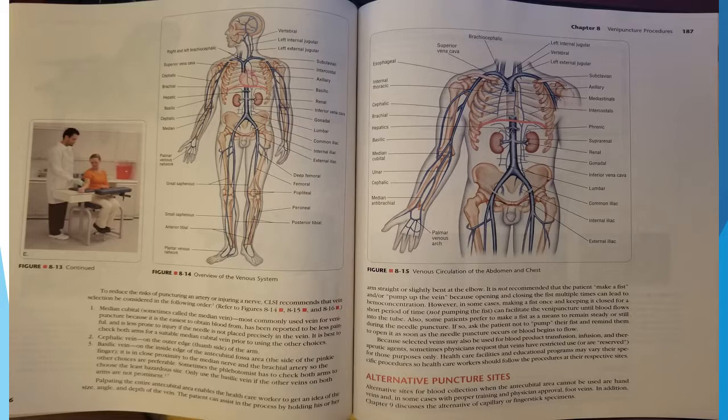Alternative puncture sites. Alternative sites for blood collection when the antecubital area cannot be used are hand veins, and in some cases, with proper training and physician approval, foot veins. In addition, Chapter 9 discusses the alternatives of capillary fingerstick specimens.